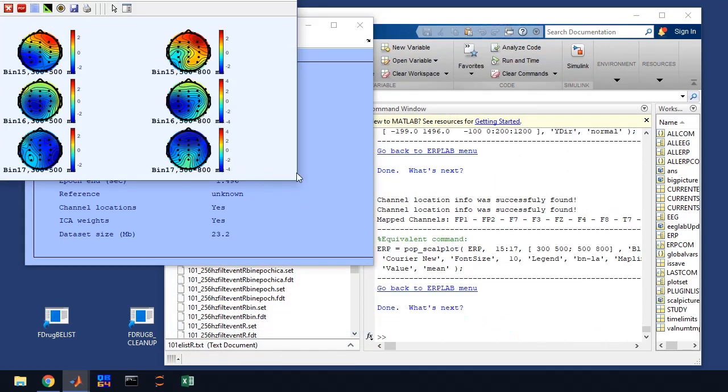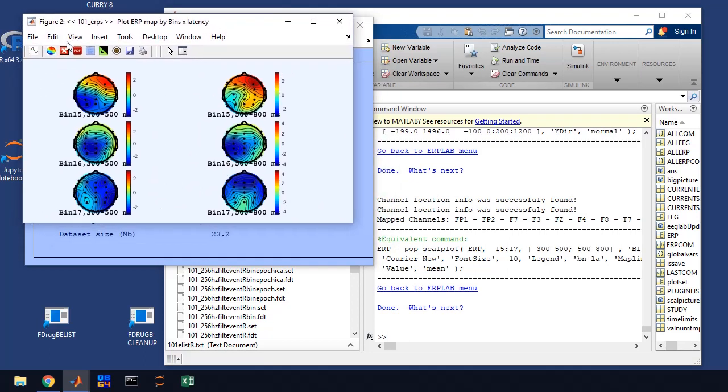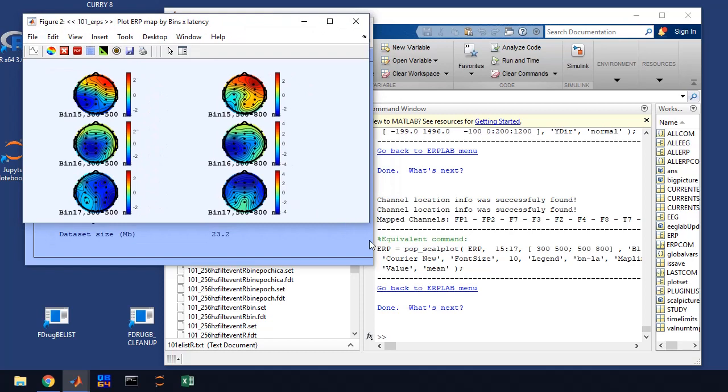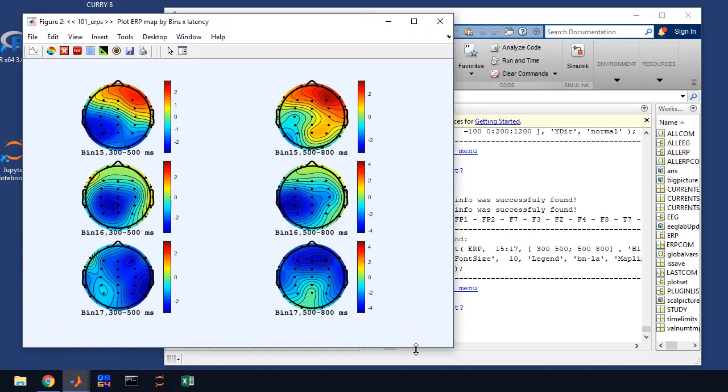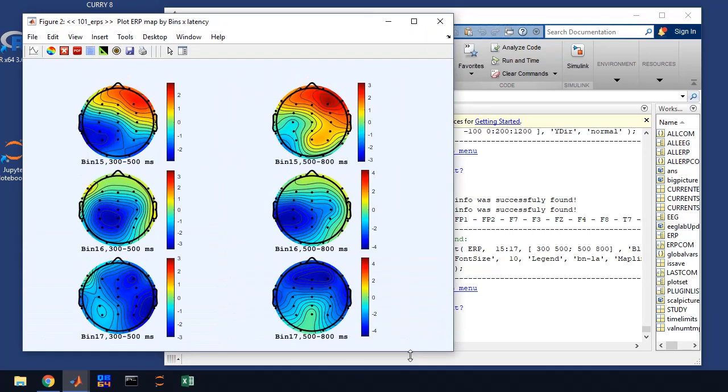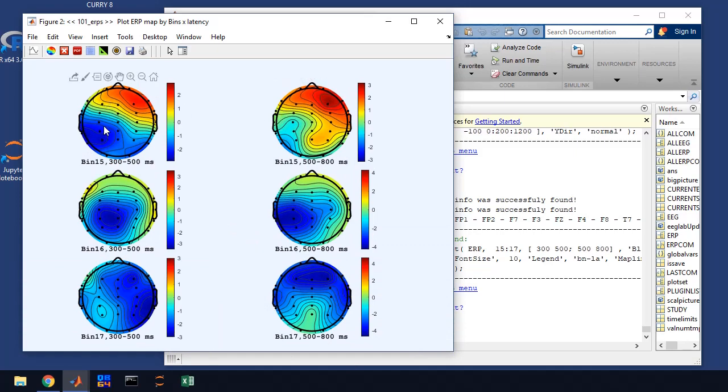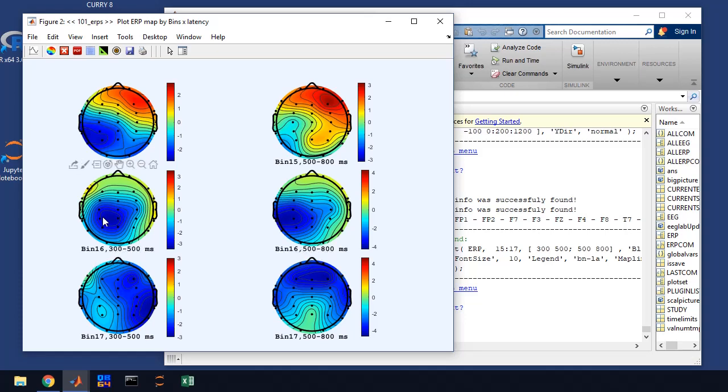I'm going to bring it down so you can see it a little bit better. There we go. So this top row here is our study phase, and that's drugs minus fake drugs. So you can see there's a good bit of difference there. What we're looking for here is what's the scale. Is it roughly five microvolts or so. If it's a really huge scale, that suggests there's some artifact that didn't get detected.